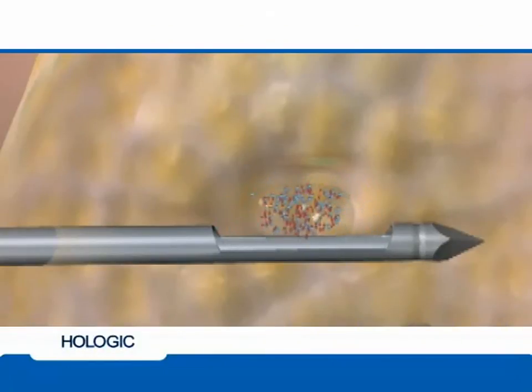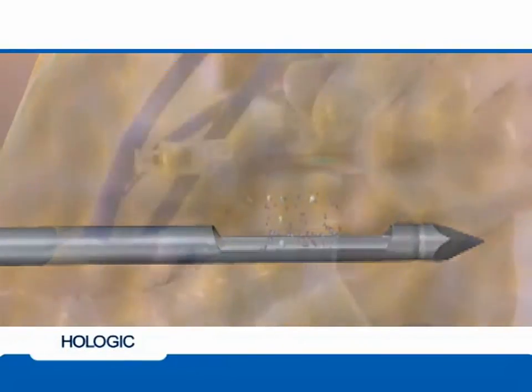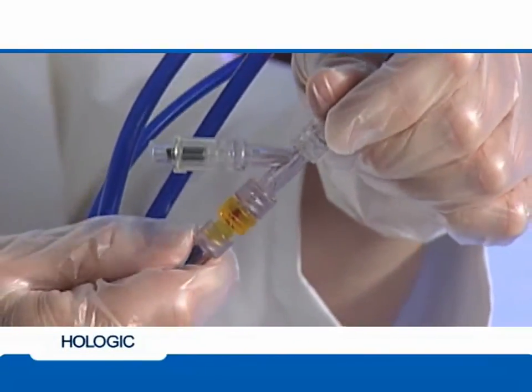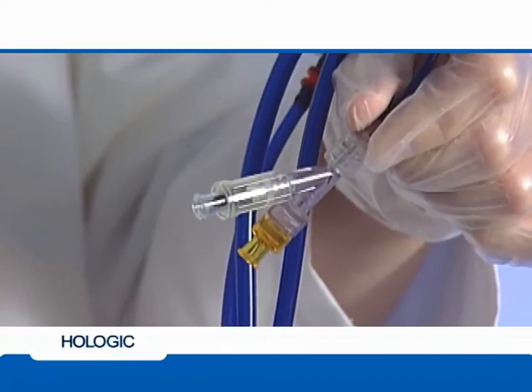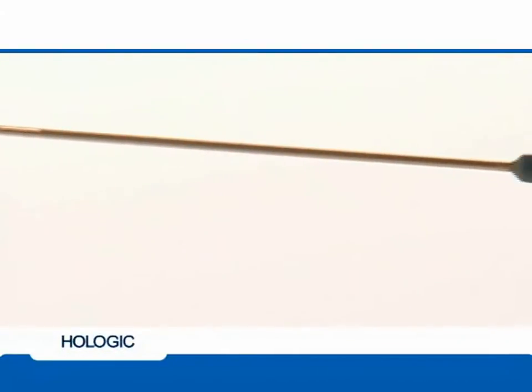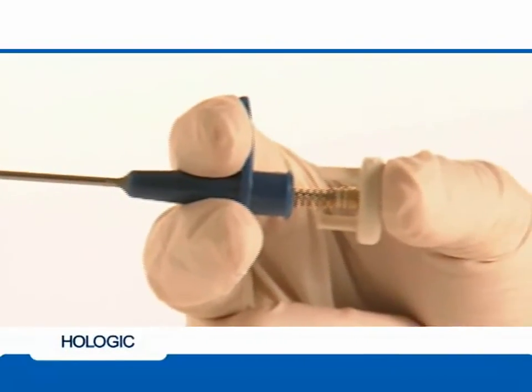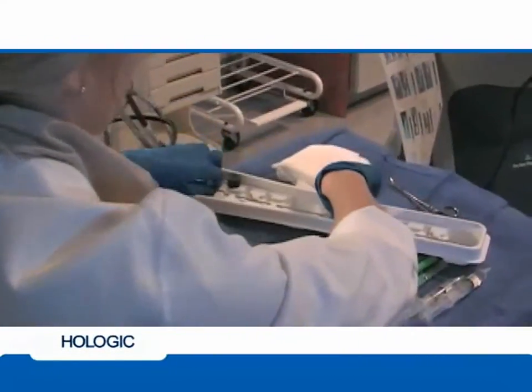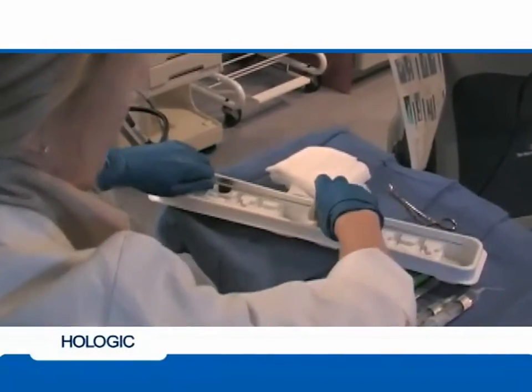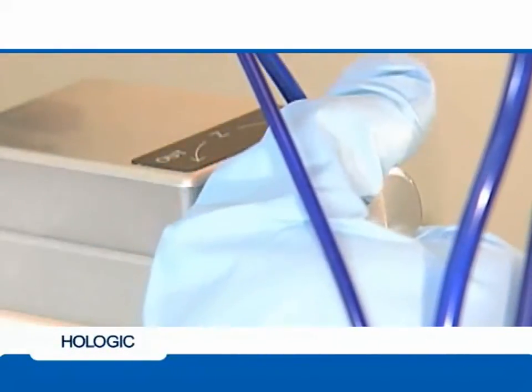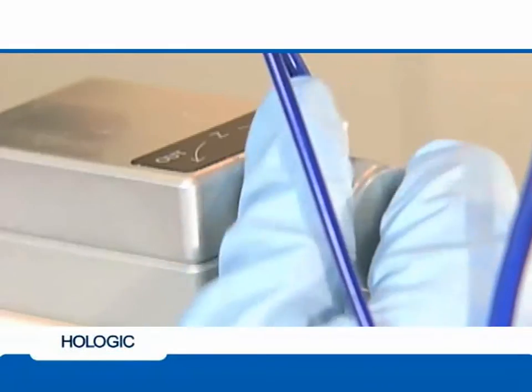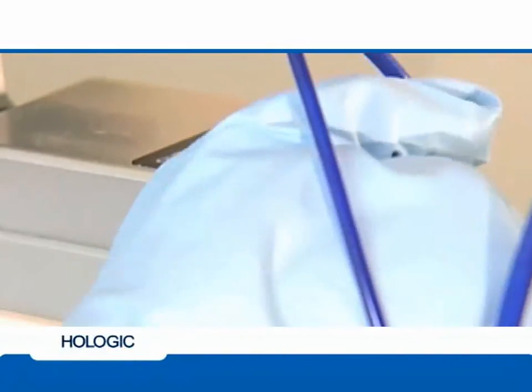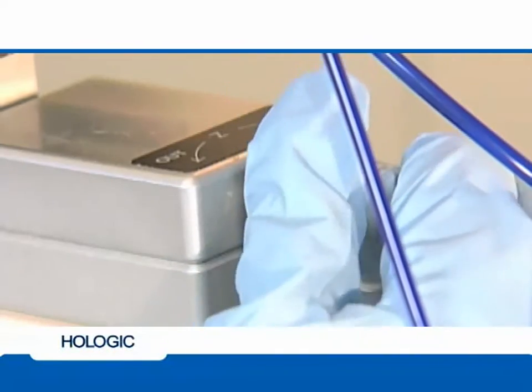Continue to lavage and aspirate in the biopsy cavity. This will assist in preparing the biopsy site for biopsy site identification placement. When you have verification that the samples have been successfully retrieved, disconnect the saline line at the proximal end of the Y-valve or at the yellow connector. You are ready to begin marking the biopsy site by placing a biopsy site identifier in the biopsy cavity. For this demonstration, we will be using the ATEC TriMark biopsy site identifier. If you used an ATEC petite handpiece, begin by dialing back the Z knob 3 millimeters. If you have used a standard ATEC handpiece, dial the knob back to 7 millimeters. This allows the marker to be deployed in the center of the cavity.